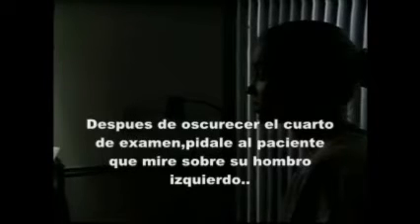After darkening the room, ask the patient to look over your left shoulder at a specific spot on the wall. Look over my left shoulder. Using your left eye and left hand, examine the patient's left eye.